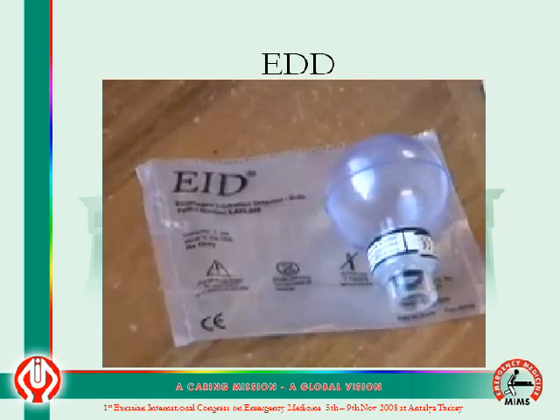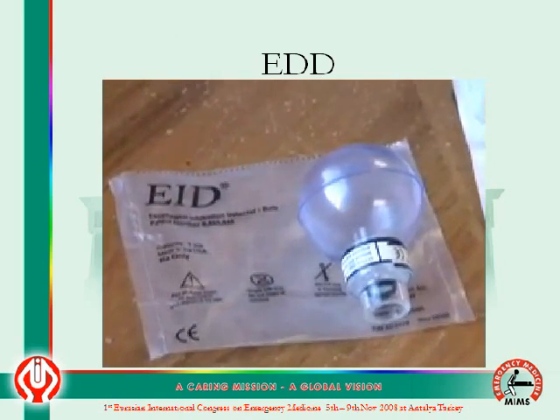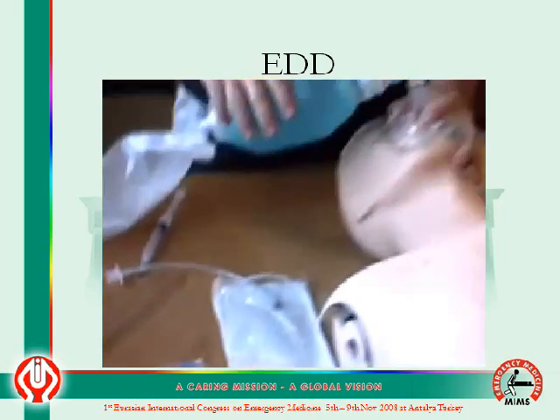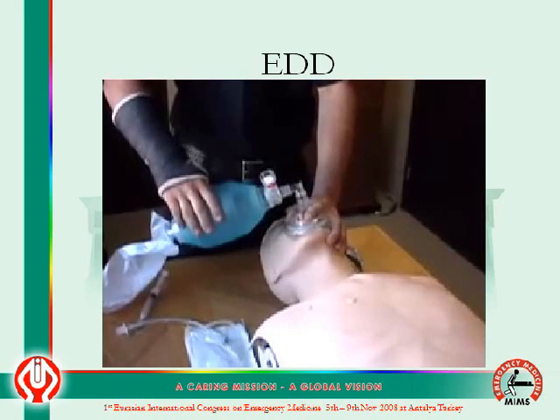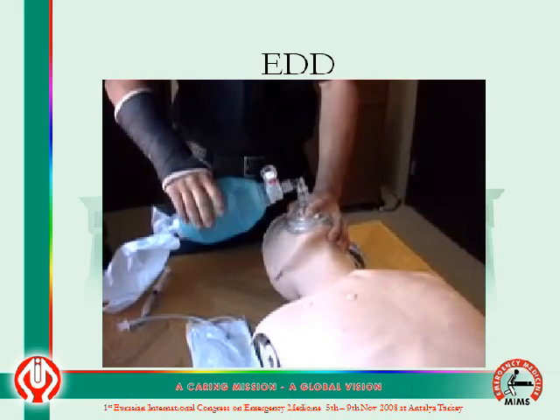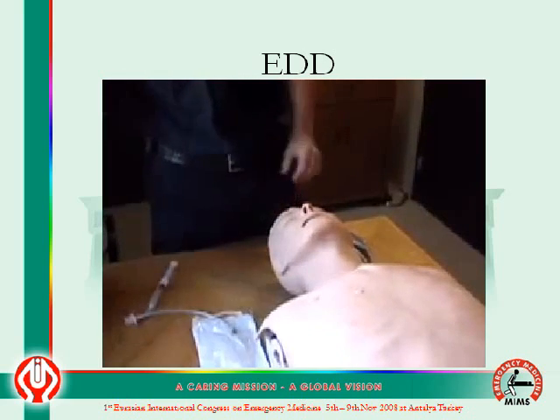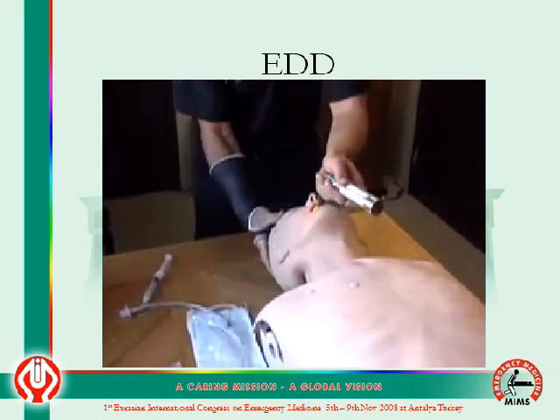This video will depict the use of the EDD, the esophageal detector device. Patient is currently being ventilated. Intubation begins.